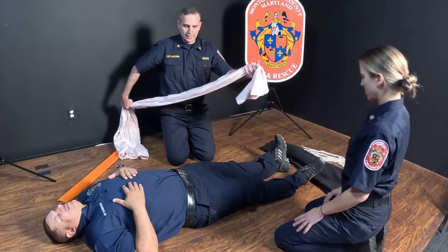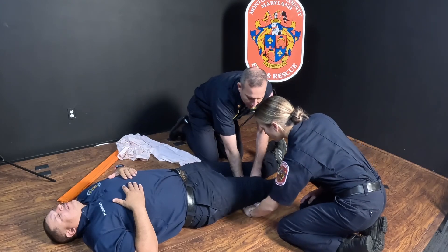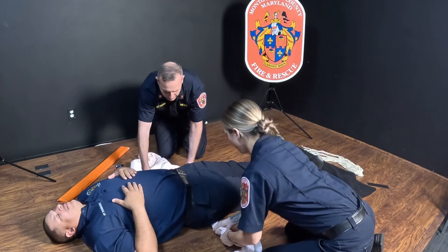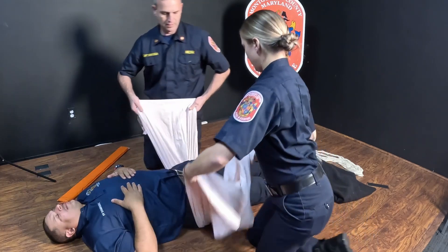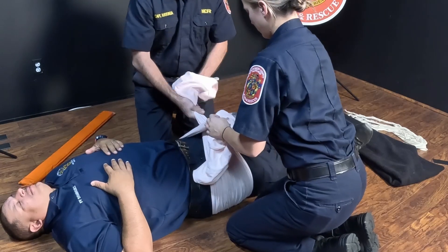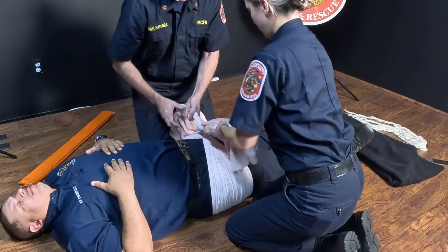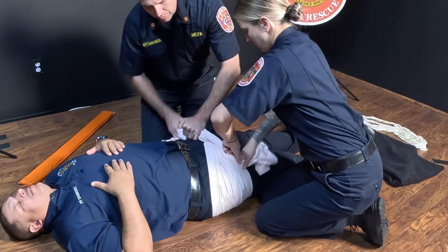For the pelvic splint, we're going to take a sheet and run it underneath the patient's knees. We'll slide it up under the patient's pelvis and spread out the sheet. We're going to pull tight and cross over. Both clinicians continue to pull while we cross a second time, and we'll cross one last time, continuing to pull tension on the sheet and then wrapping it underneath the original part of the sheet.